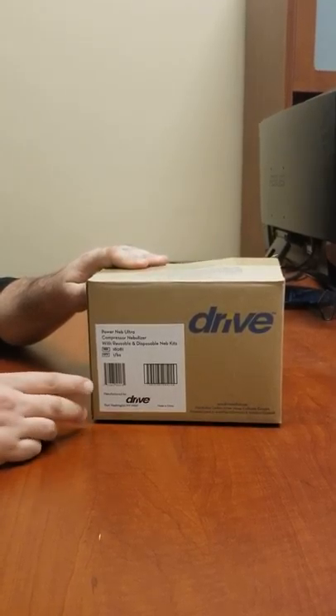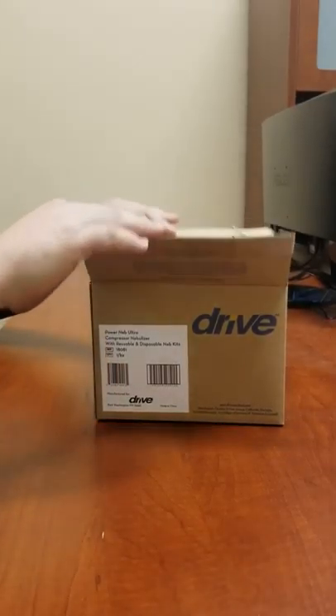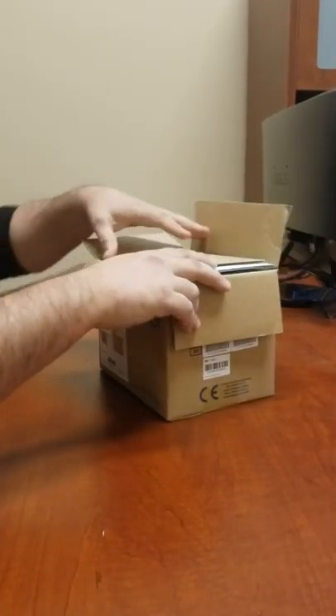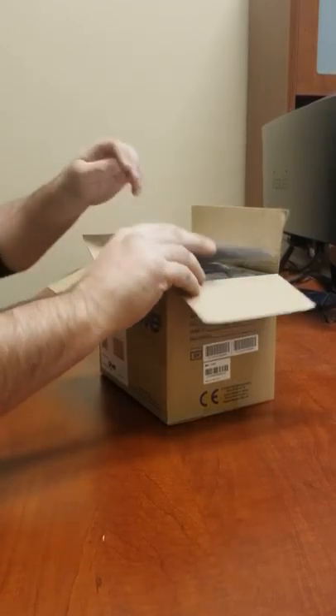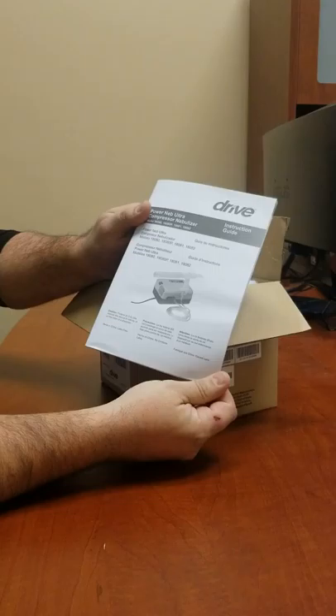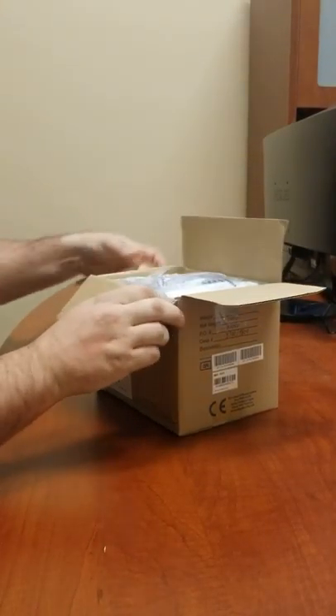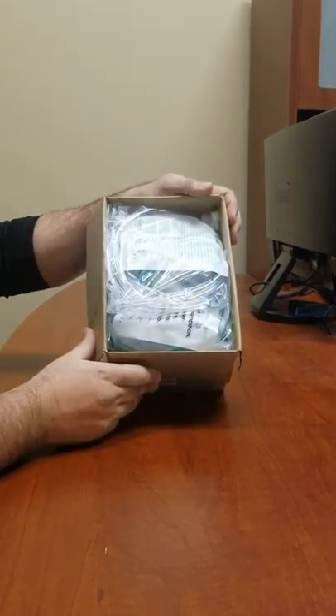In this video we're going to go over when you receive your nebulizer: what is included and how it works. First you'll just want to open up your box. It will come with a manual, so if you have any questions you can always go to the manual. Your box should look something like this.